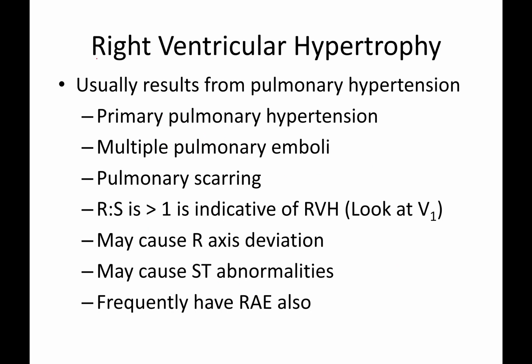All right, right ventricular hypertrophy. This one's actually not too bad to do either. Most often it's pulmonary hypertension that causes it.